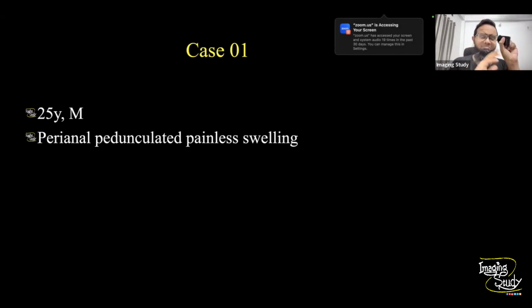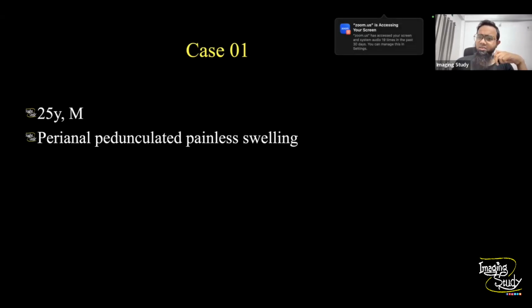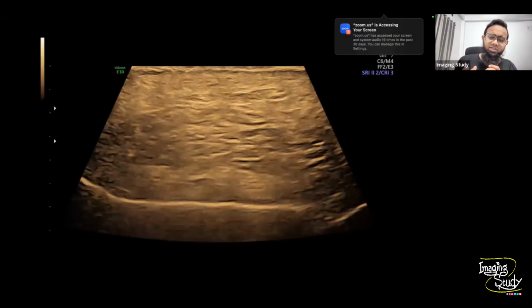It was painless. It looked like a similar skin pattern. It quite looked like a scrotum actually. So I was a little bit confused looking at that, why the patient was keeping this lesion. The clinician sent me this patient just to determine whether it's a vascular lesion or something else. So, let's start with the view. I put the high frequency linear transducer over the lesion.